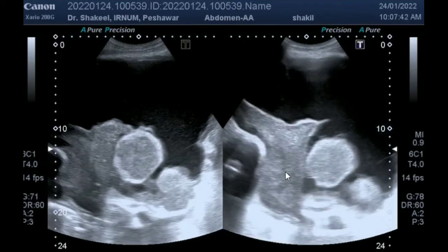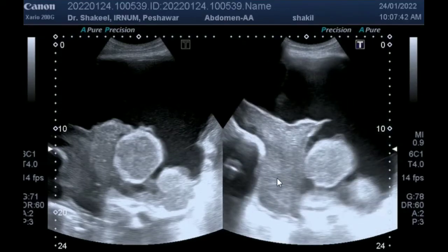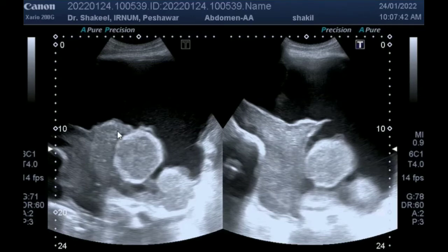This is a good image which shows the collapsed lung, and this is the mass which is arising from the lung tissue. It was reported as a malignant mass of the lung with pleural effusion. Thank you.